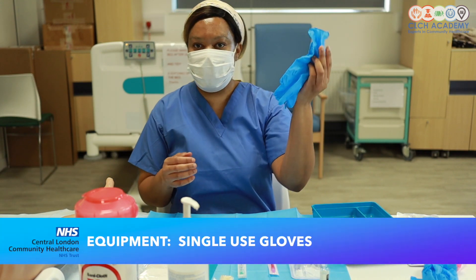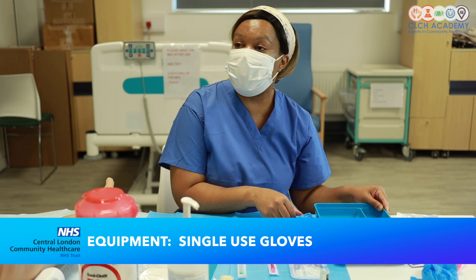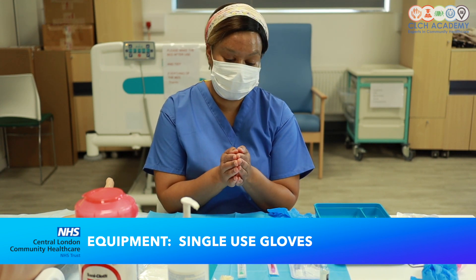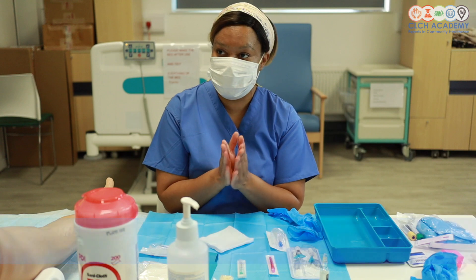I've also got a set of gloves, and you can choose gloves of your choice. However, I will suggest specifically for cannulation that you choose gloves that are as tight fitting or as close fitting as possible, otherwise it does become a little bit fiddly when we are doing dressing application and it can result in a messy dressing.